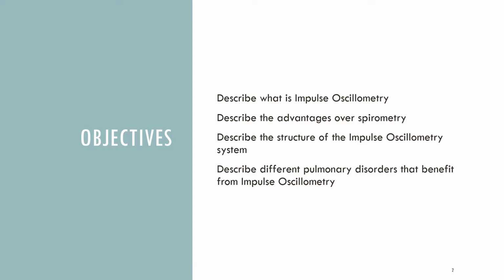So in other words, with spirometry, sometimes you have to coach the patient and have them repeat the maneuver several times to make sure they're doing it right. But with this test, it's really kind of simple to do, and it doesn't really take much patient effort.